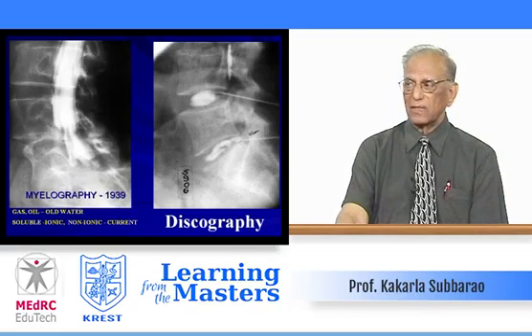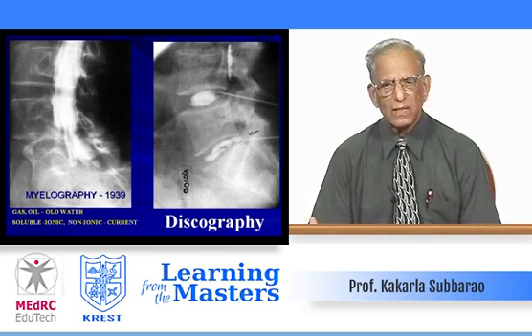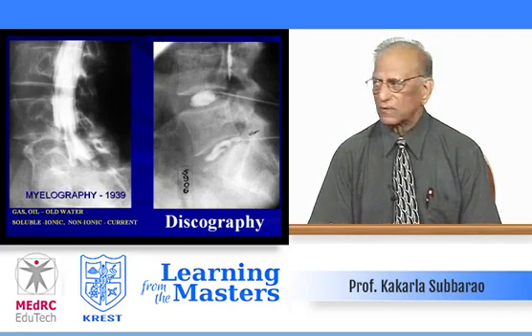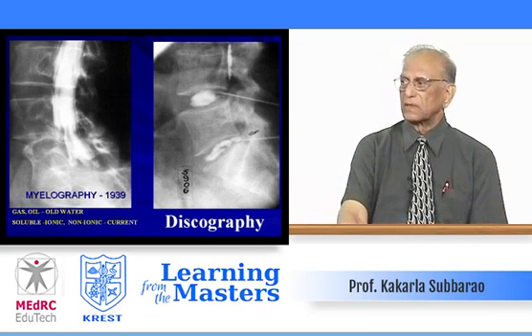Sometimes we use gas, oil, and then sometimes a water-soluble ionic media, non-ionic. Current use, of course, we don't use in many places, but say in a district place, where without a CT or MRI, you have to use contrast myelography in order to make a diagnosis. But in general, they refer the cases to the tertiary care centers. Discography, to study the disc, degeneration or prolapse. All these are abandoned now.